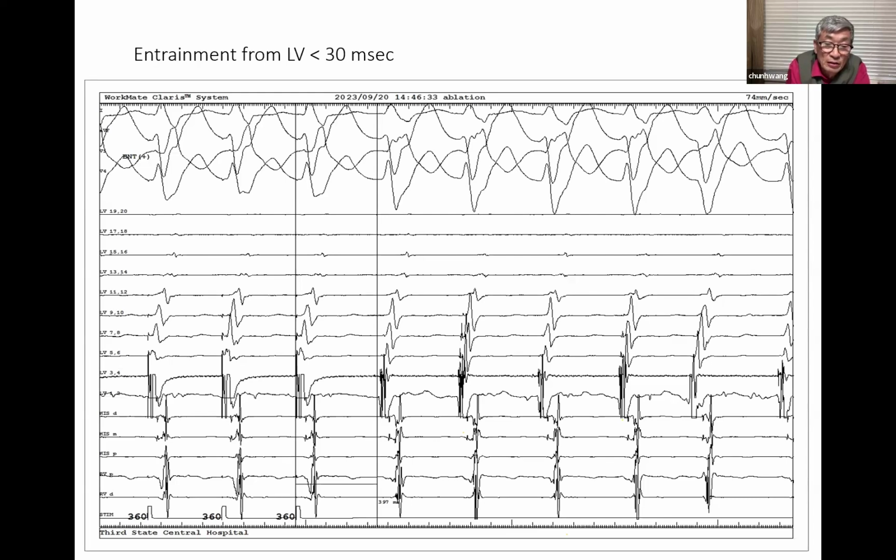When you start capturing, take a look to make sure that the local capture is only fascicle, not the local V. You can see your pacing does not match the QRS complex. Can you see that? Yes. The paced complex versus the clinical VT, they're not the same. So it's not concealed. So make sure that you take care to zero down the output and then look at it.